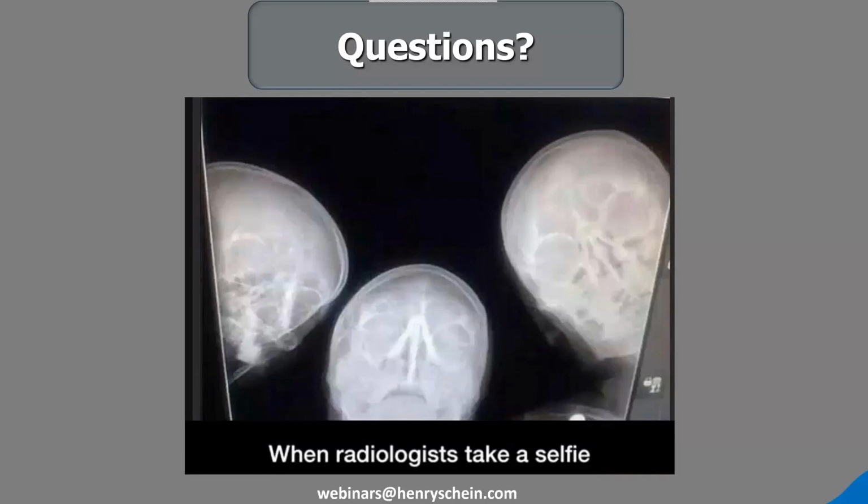Great. Here's another. How would you decide who to use this tech on? Well, that's an excellent question. There are some 3D guidelines that we can go to. What we're seeing with some people is that they will take a panoramic or their full mouth series, and then if there's something they can't quite tell what it is, or if they're not able to diagnose the patient's pain or discomfort, then they move into 3D. Or if they're going to be planning an implant, then they'll move into 3D.